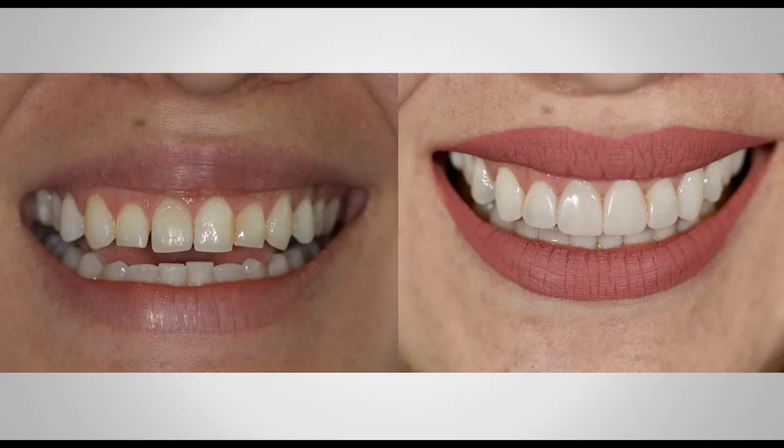Even though all these restorations are bonded one right next to the other, after we bond them, we use a diamond burr. We kind of open the gingival embrasure to give our patients some room to go back and clean while they're using the prototype. And if you ask yourself, how motivated you think your patient is going to feel immediately after you deliver these prototypes, and you send them home with the prototypes, so they're now able to function with them.